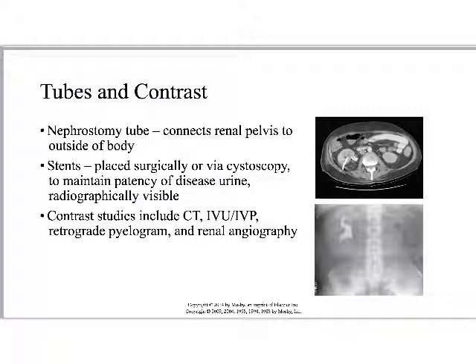Since the iodine is completely useless to the body, the kidneys filter it out, and now we can get a functional picture of the kidneys filtering out contrast. So it's access intravenously, and a functional image of the kidneys filtering out contrast. I always laugh a little to myself when folks from Nuke Med talk about how they're the only people who do functional images. That's not true. Otherwise, what was I getting paid for when I did all these contrast studies? Those were functional images.